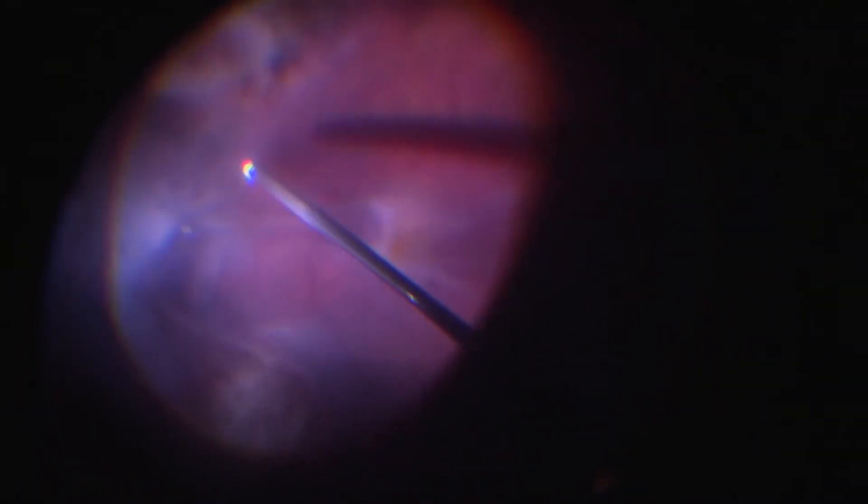Multiple opacified bands of vitreous and PVR are observed with radial extensions from a contracted, partially separated hyaloid face. The optic nerve and fovea are initially obscured.